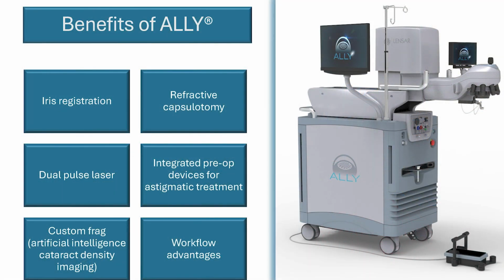This is the unit that we're using. There are many different types, several different models, but this happens to be the latest generation and quite frankly the most sophisticated, and it does produce the ability to very accurately place the implant for a toric correction. It uses 6 Scheimpflug cameras. Importantly, it registers the cornea, the lens depth, and interestingly, the lens density itself. So here's a short video.